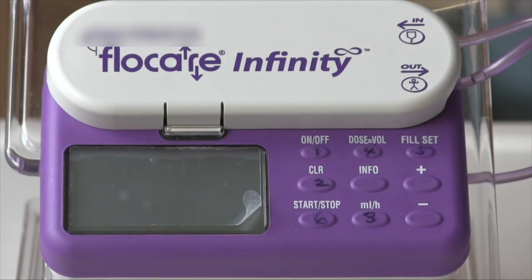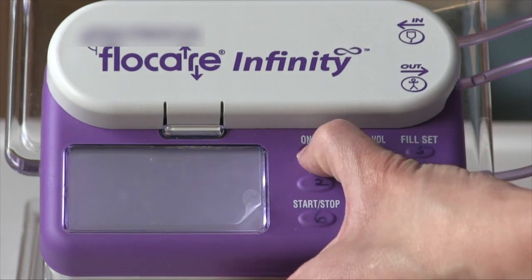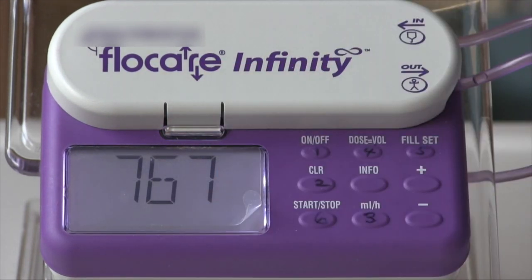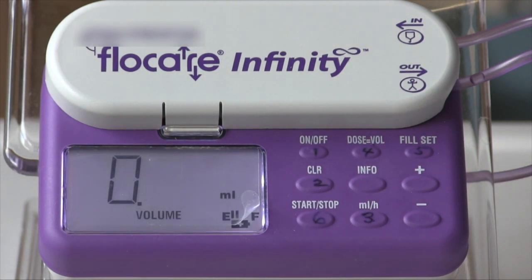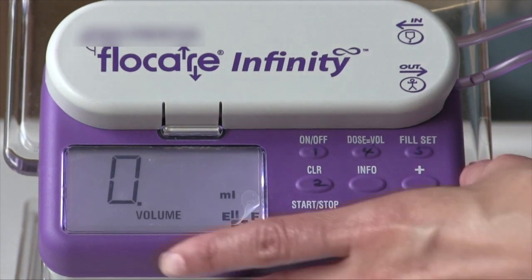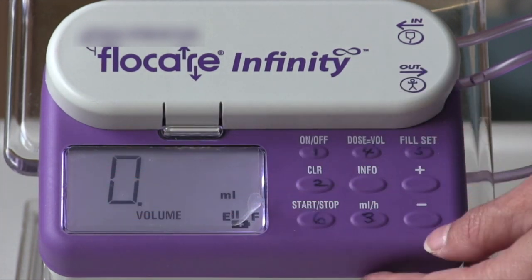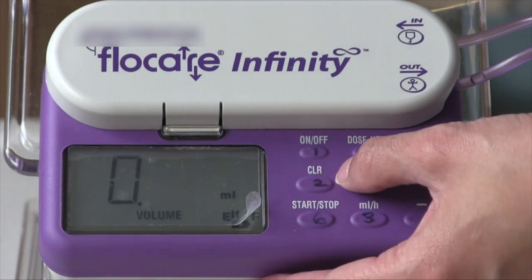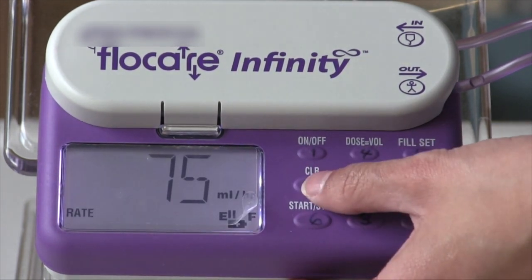Now that you've set the giving set into your pump, we'll turn on the machine. You'll go to the on-off button, hold it down for 2 seconds until you hear a beep, and then it will run a self-test. Once you have reached this screen that says volume, you are ready to program your pump. The volume displayed will tell you how much feed you had previously. You need to clear this to allow your pump to reset. Press the button labeled CLR, which means clear.